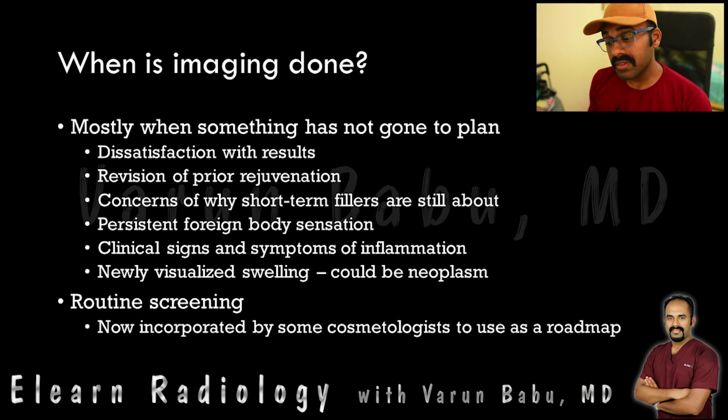Nowadays, in fact, many of the cosmetologists are doing it as a routine screening prior to injecting fillers, as well as to use it as a roadmap when doing repeat filler placements.